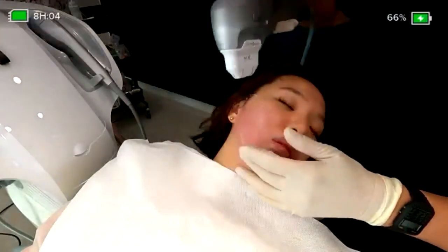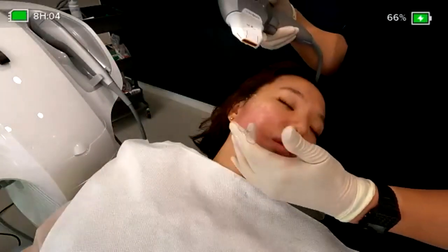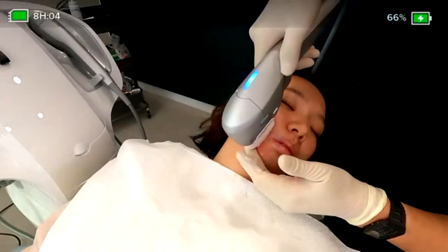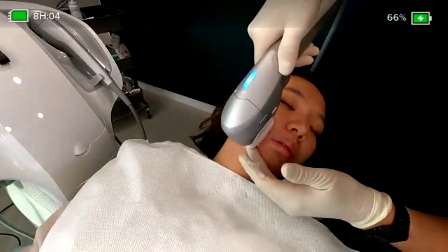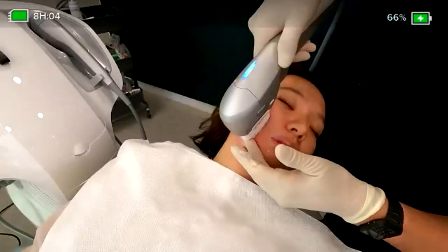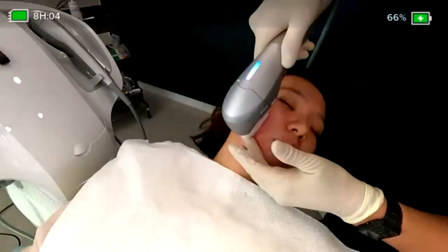You can see how the wrinkle reacts or how the wrinkle is moving here. So we are making the parallel direction in the opposite direction. And this is the last pass for the pre-jowl wrinkles and laterally to the angular lips.